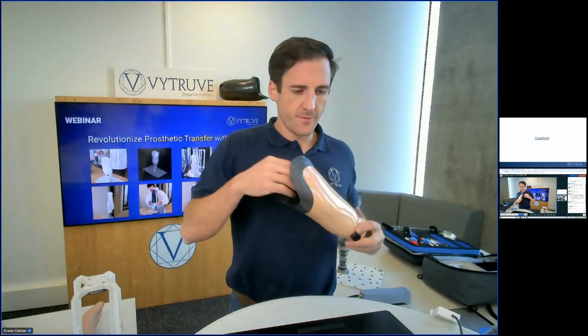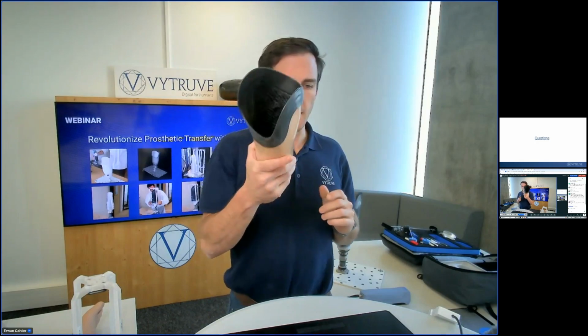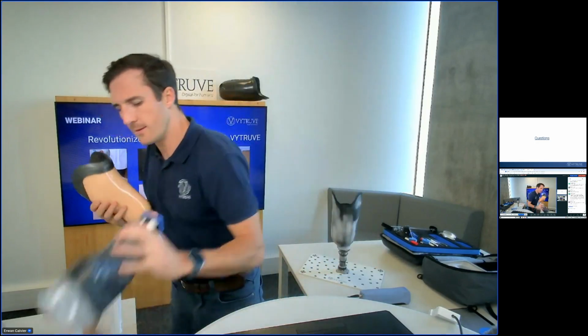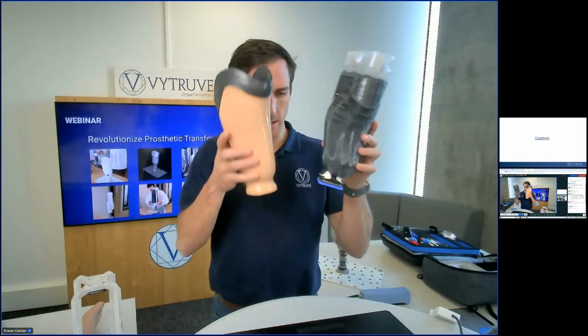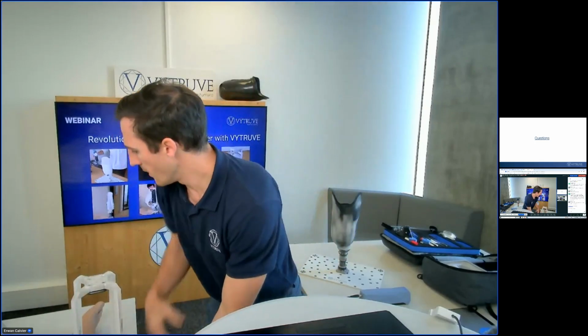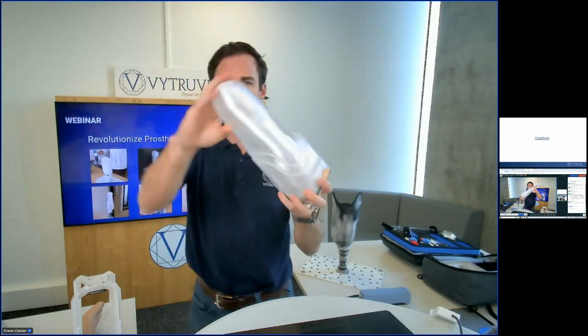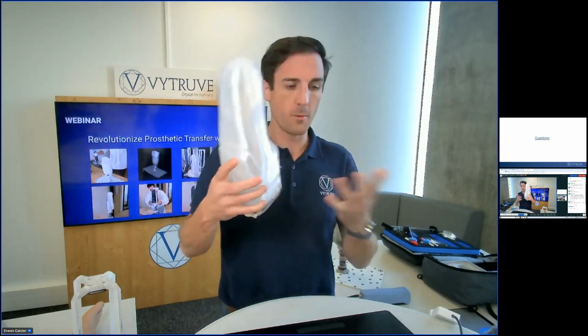This socket is very small, but it's really not a problem. If you can see this one, this socket, it's also very small and it's working. If you see this positive at the end, it's also very small and long, but it's working.